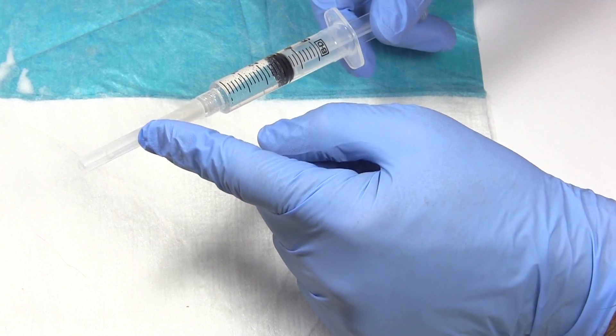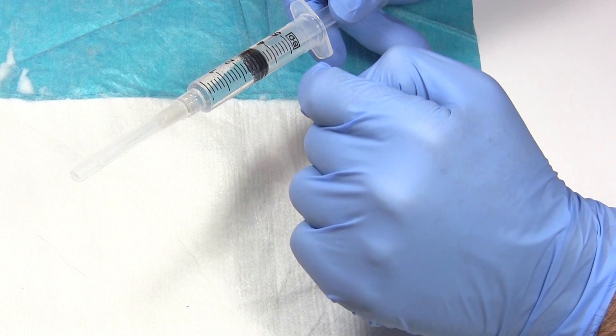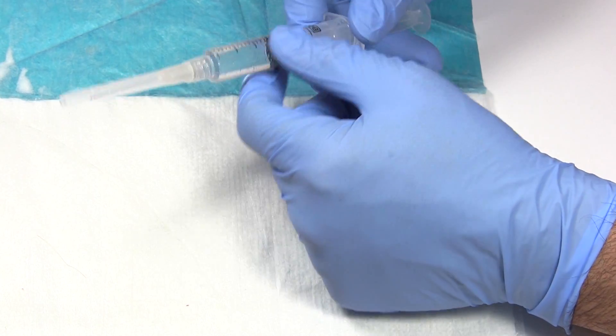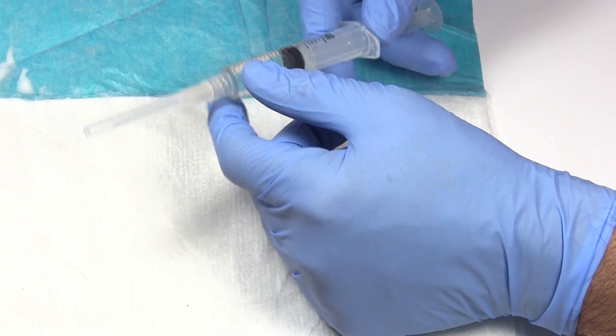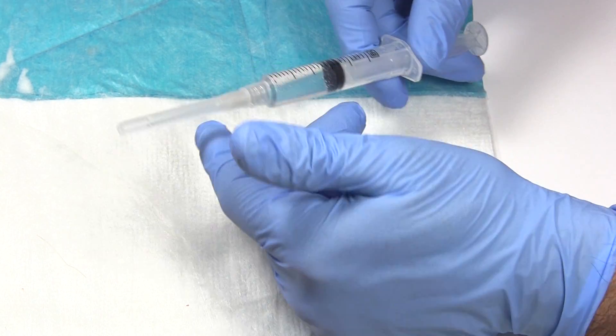You need something to anesthetize the wound — a syringe, a needle, and some anesthetic like lidocaine or marcaine. Today we're using water. For needle size, you want to use as small a needle as you can, because that causes less discomfort to the patient. So 27 gauge, 30 gauge — depending on the body part. On a face I'll try to do a 30.